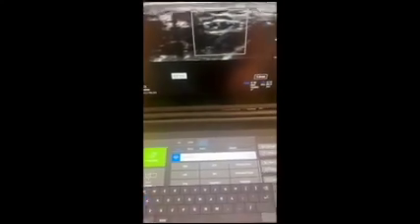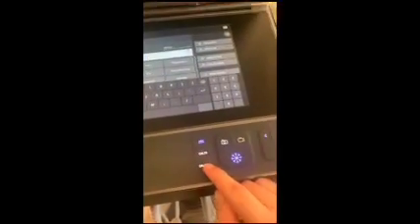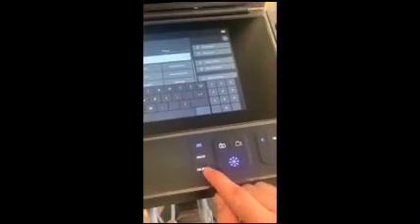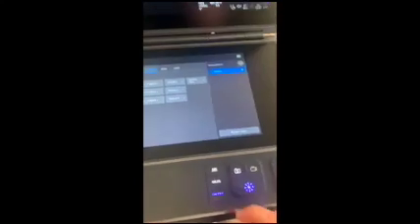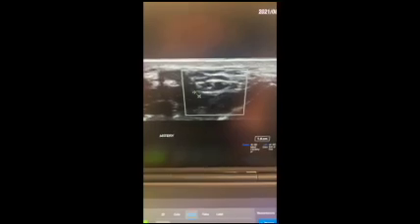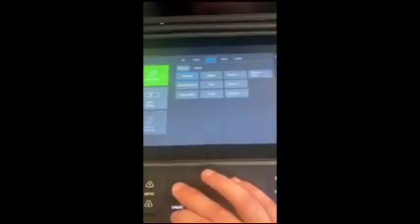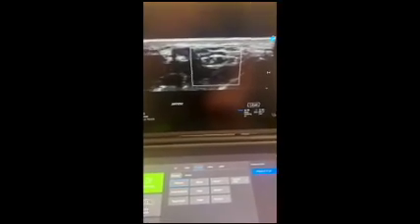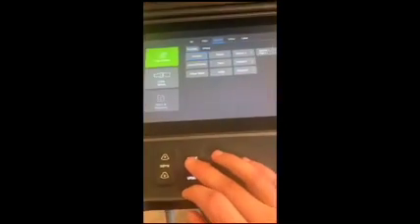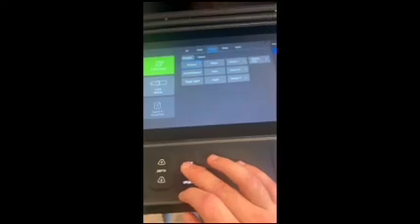If you want to measure something, you can click caliper. You will see two hash marks on the screen. You can move those, then click select. Move the other one, press select again. It'll freeze it, and it'll give you a measurement over here.